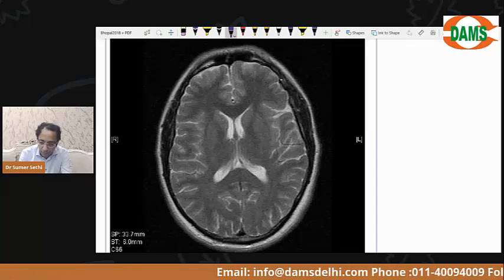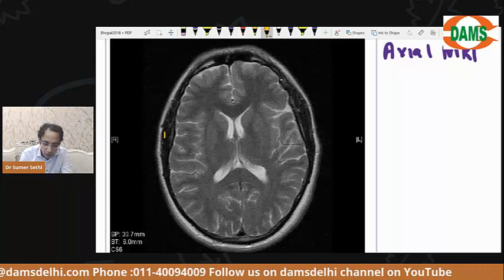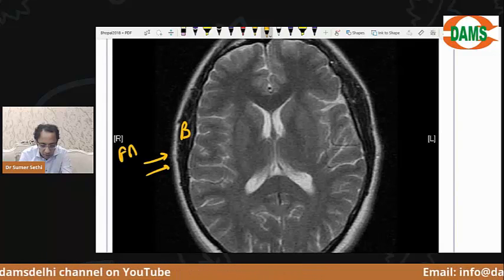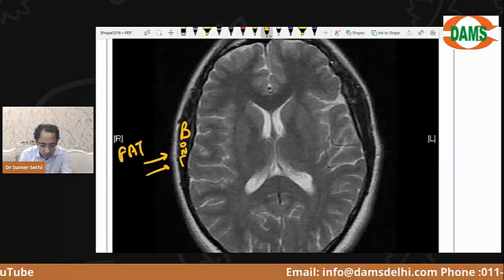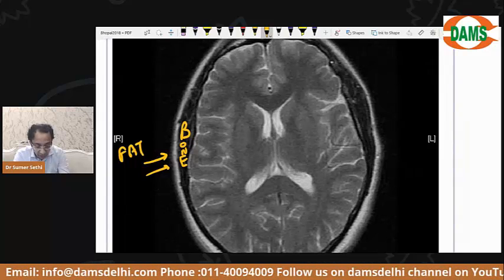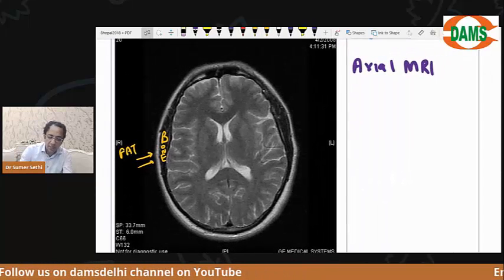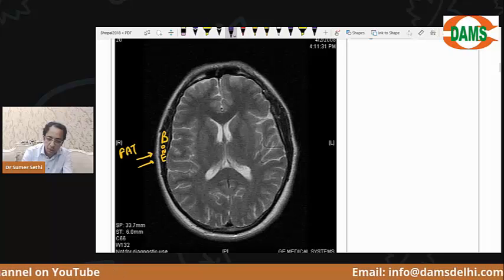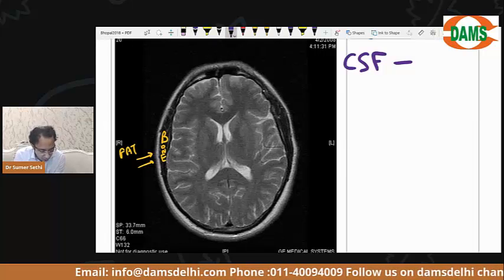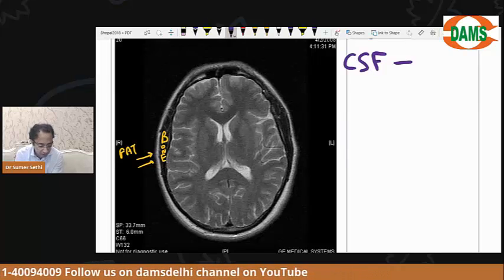Listen to me. This next is again an axial MRI of the brain. You can see the bone is dark, fat is white. Okay, I'm sure you agree that even in the next image, the bone is dark, the fat is white. Okay, bache? So this is an axial MRI. I want you to answer, all the children, what is the color of CSF in this image?